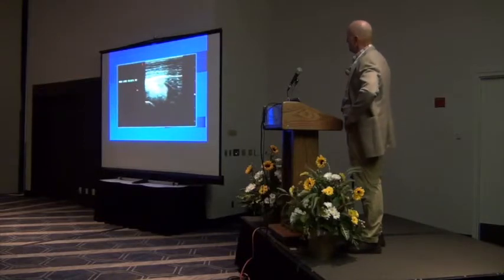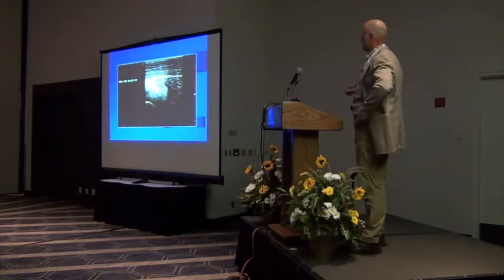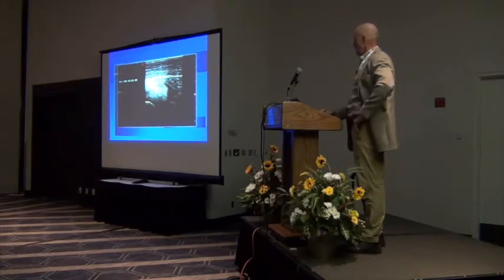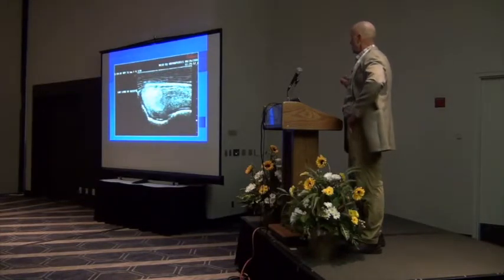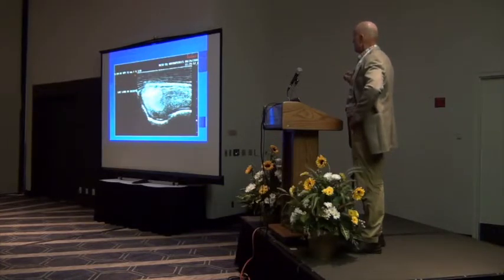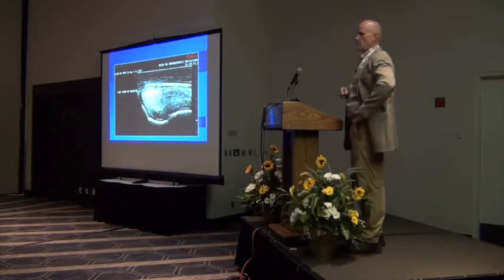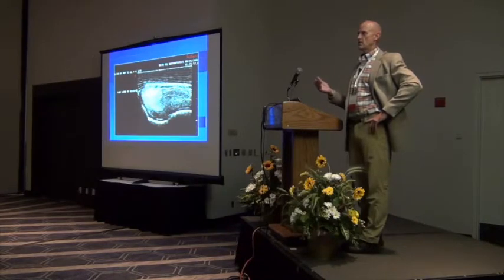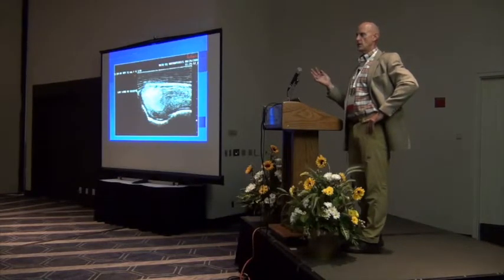Here we are coming down, and this is going to be the medial lobe. The medial lobe, if you look, is going to be deeper than the lateral lobe. There's an intertubercular groove. We need to spend more time looking at that border. Thankfully, there's that little muscle that I was telling you about that's not abnormal. And this is the greater tubercle coming up right here. And that's thankfully where we see a lot of the fluid accumulation and bursal hypertrophy, right at that junction between the greater tubercle and the lateral lobe.